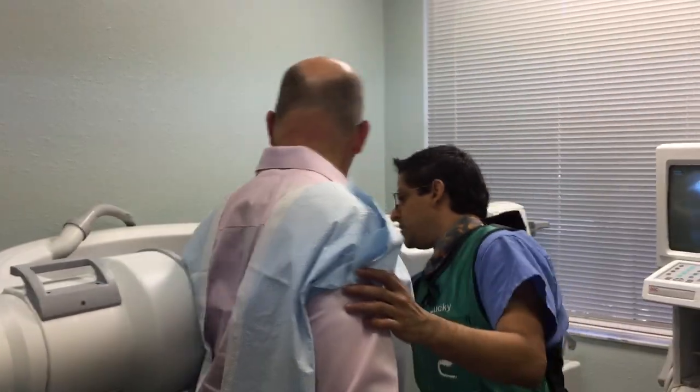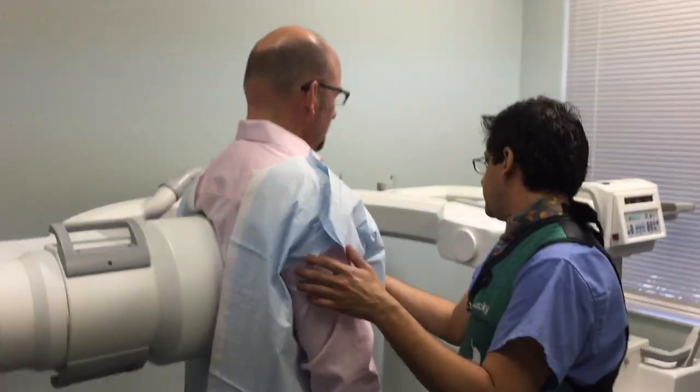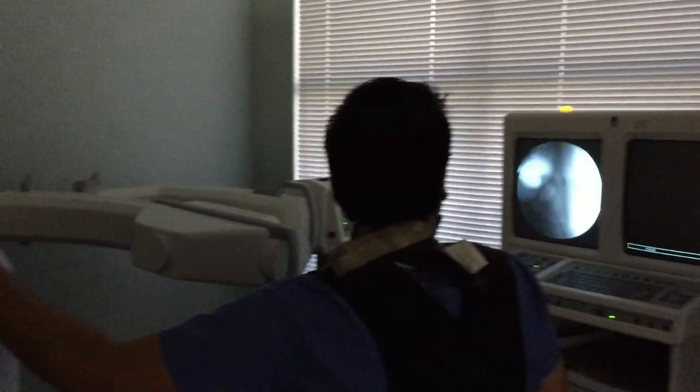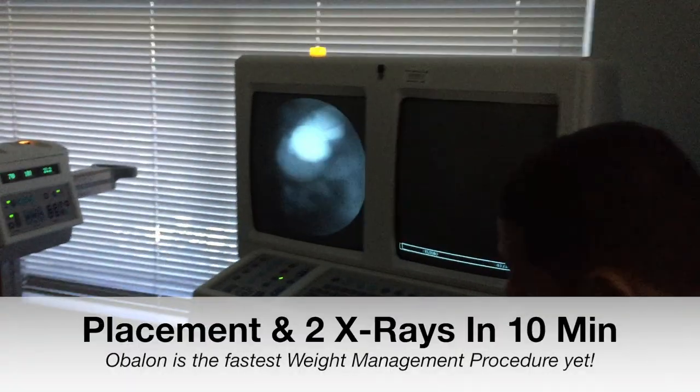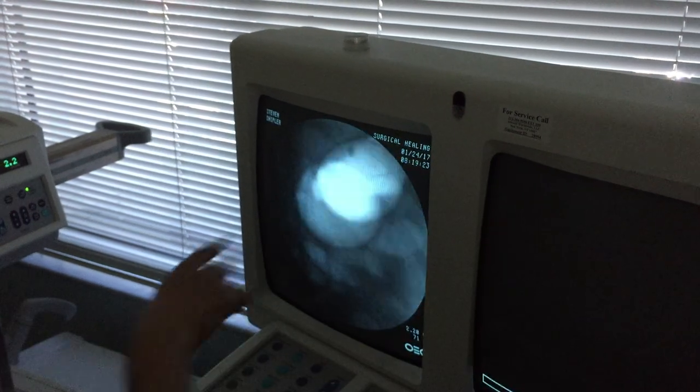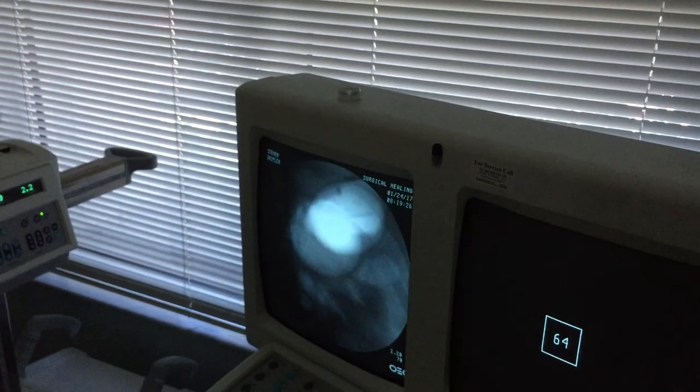How do you feel? Great. I just feel fuller, for sure. I drink a lot of water, there you go. There's two balloons right there. I'm going to get a better shot — balloon one, balloon two. Thank you. Thank you sir. That was easy. You made it easy.